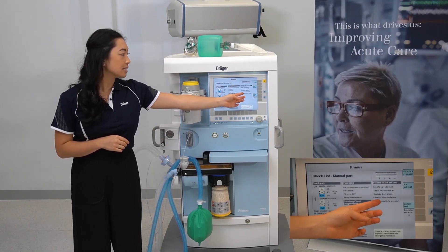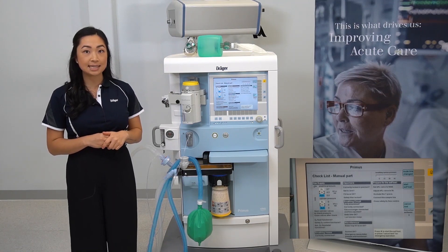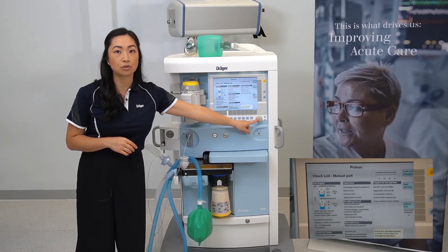Verify your safety oxygen flow control is closed. To start the system test, either press the start self-test shortcut key or confirm with the rotary knob.